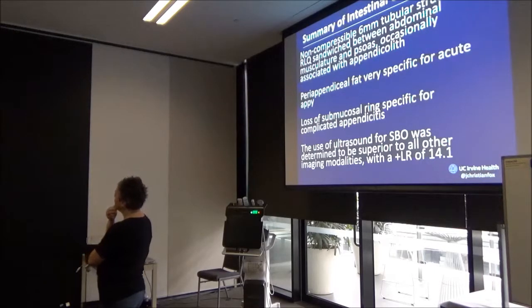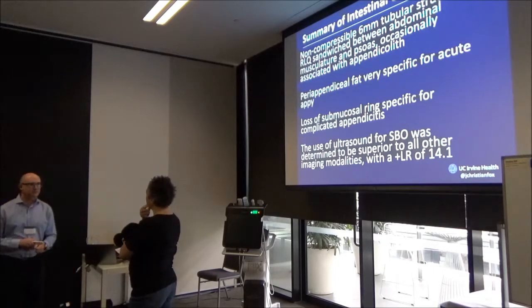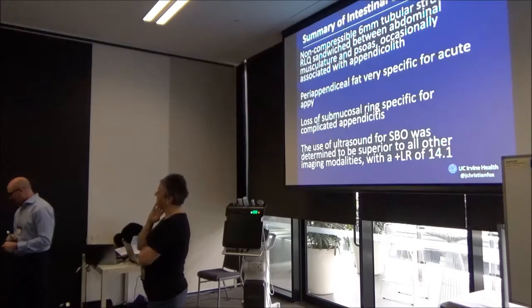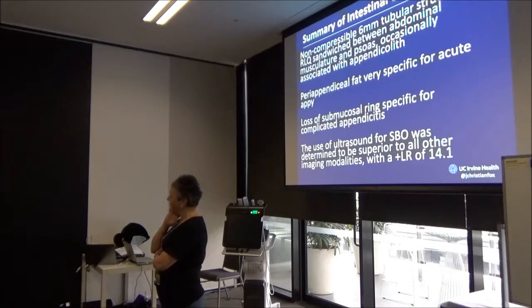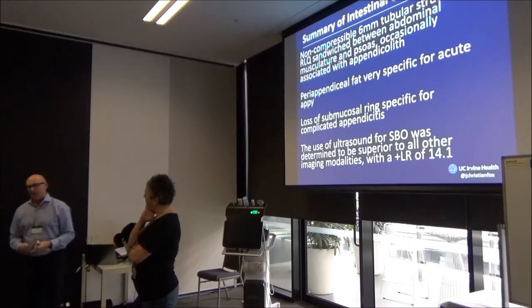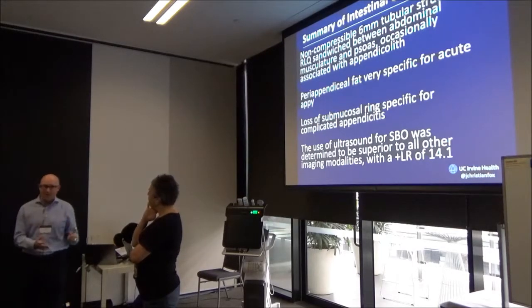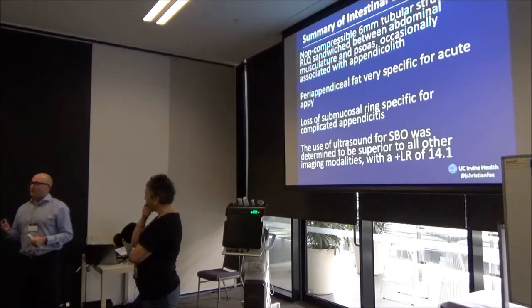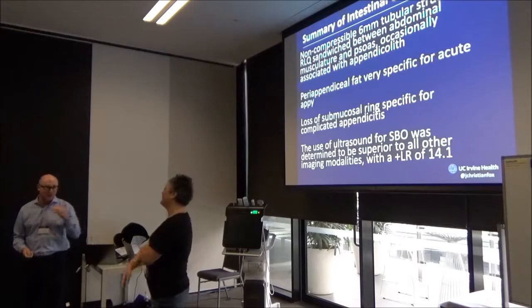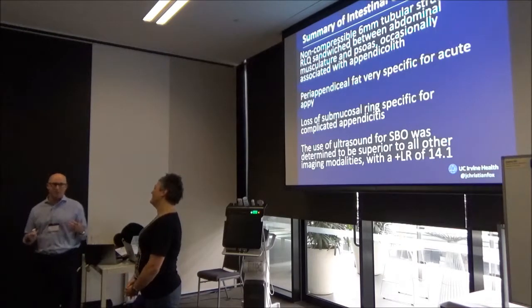How successful are you at picking them up when you've got large BMI patients? Yeah, the BMI thing is definitely more difficult. All the studies show as the BMI goes up, the accuracy of ultrasound for appendicitis goes down, for sure. But the more you do it, the better you get at it. And when you find it on a patient with a large BMI, you feel so good about yourself. It's like you just won the game. It feels really good. So I say keep doing it. You'll get better. It makes you stronger every time you try to do this, even if it's a large BMI.